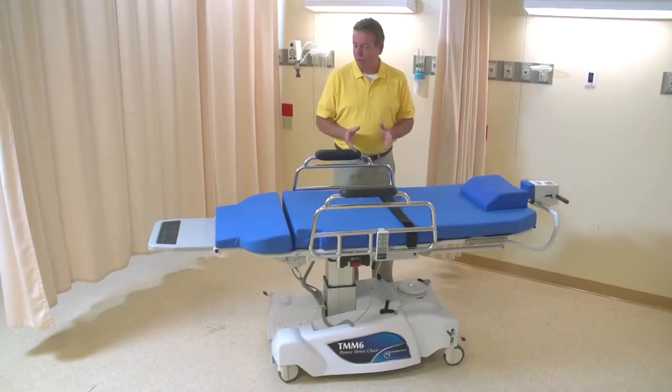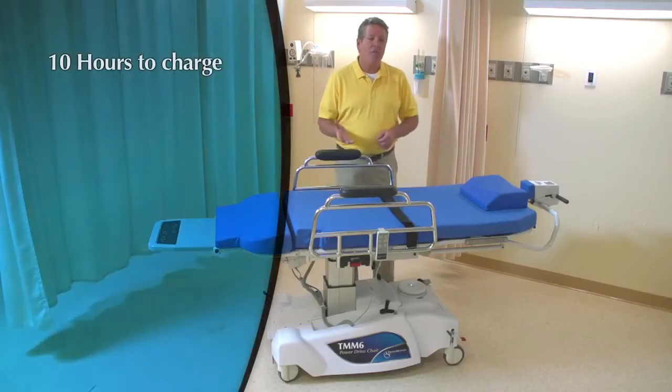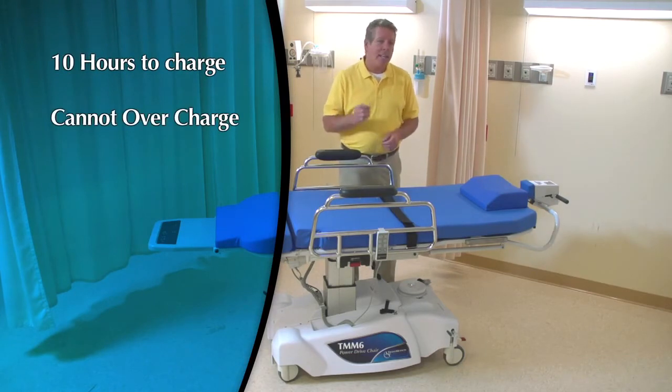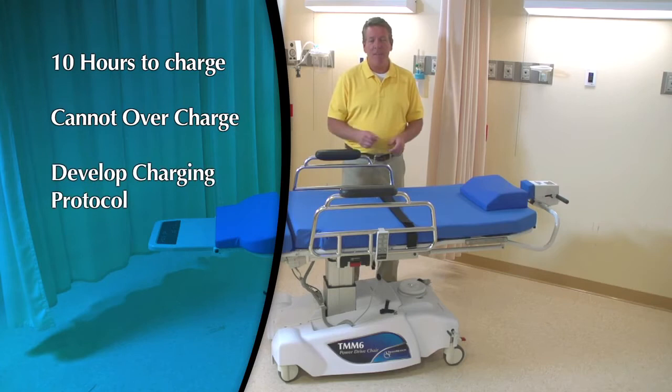While the chair is recharging, the battery charge level indicator on the interface control will indicate the current level of the charge. And once the batteries are fully charged, the battery charge lights will flash repeatedly. Charging takes approximately 10 hours. The battery does not need to be discharged before recharging, and it cannot be overcharged. This means it cannot be plugged in too much or too soon.